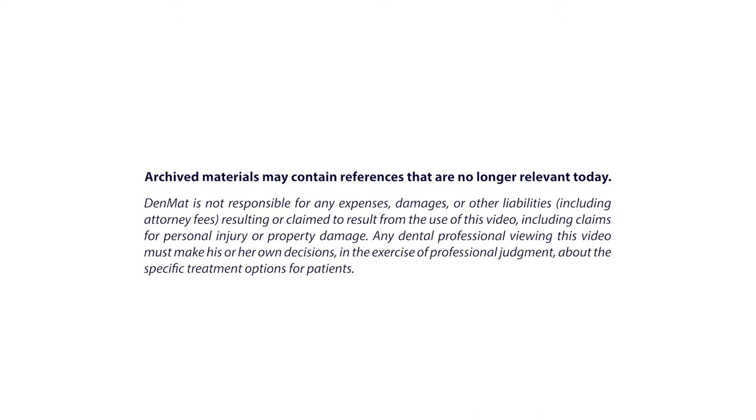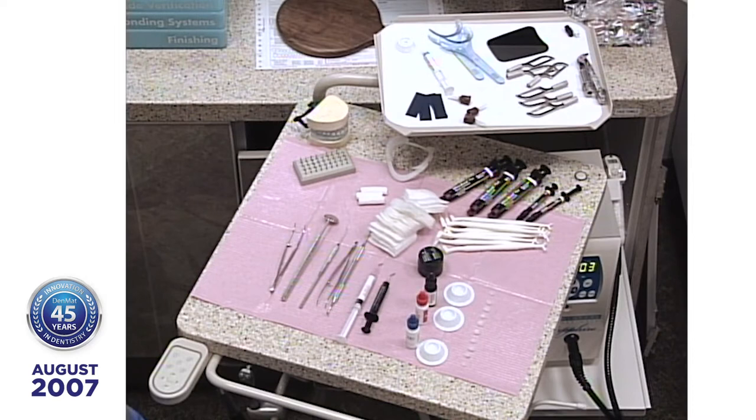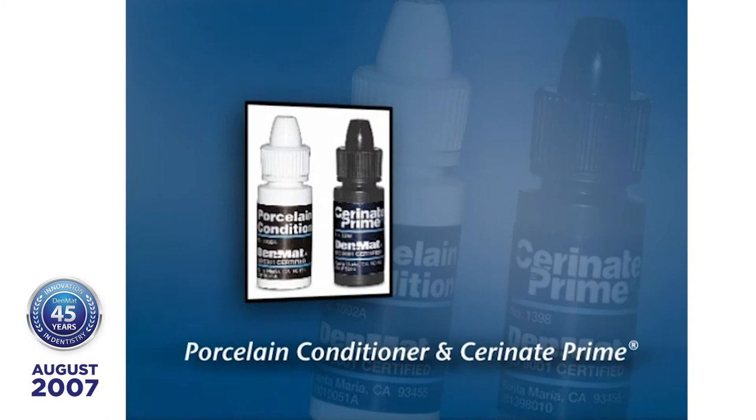Good morning everyone. I'd like to welcome you to a live webcast on our patient today. We're going to place 10 porcelain veneers on someone that appears she doesn't need anything — the only thing is she wants something. Jessica has treated these Lumineers with Cerinate Prime and porcelain conditioner. The porcelain conditioner is citric acid; you put that on first, then you put on the Cerinate Prime to activate the silane, and that's how you get the bond between the ultrabond and the porcelain, and then we bond the ultrabond to the tooth.